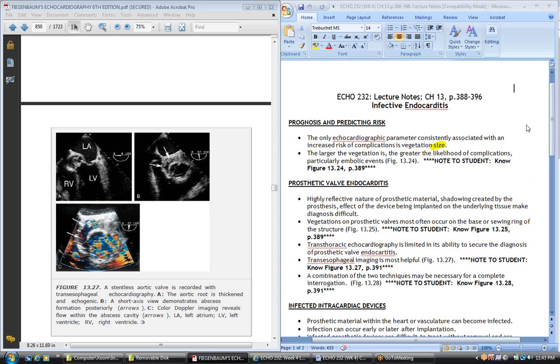So what does this mean to you as an echocardiographer? It means that it's common and very, very normal to have to do both a transthoracic and a TEE study on the same patient to try to determine with a prosthetic valve if there's a vegetation. If they feel that the symptoms and the indications are leaning towards vegetation, and we cannot see it on transthoracic, then obviously we want to go to a TEE.